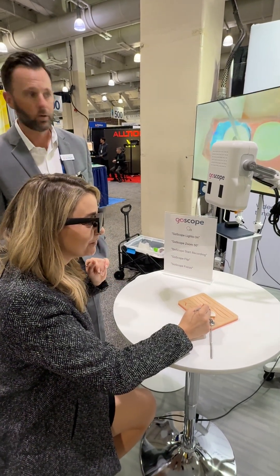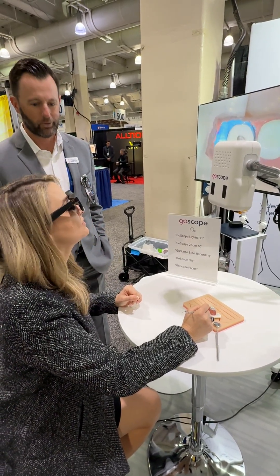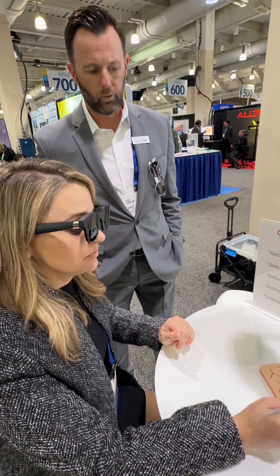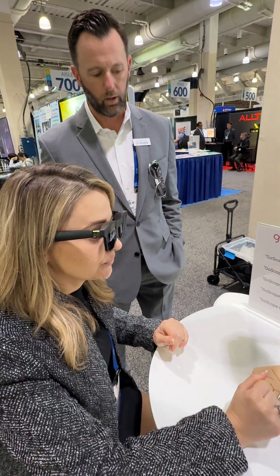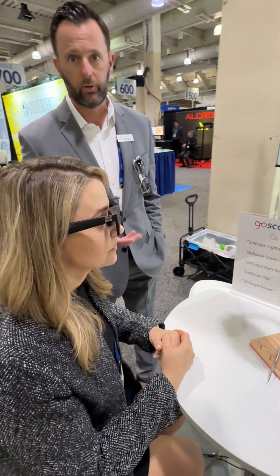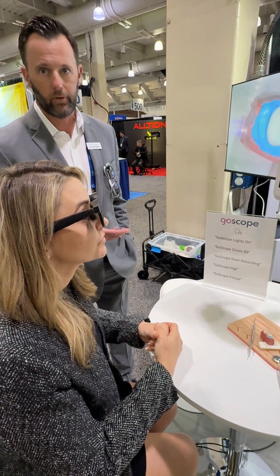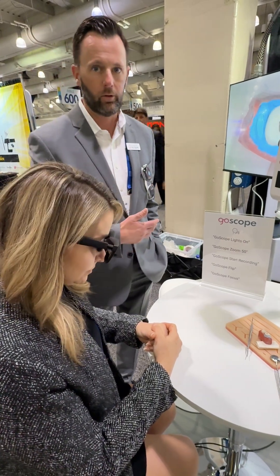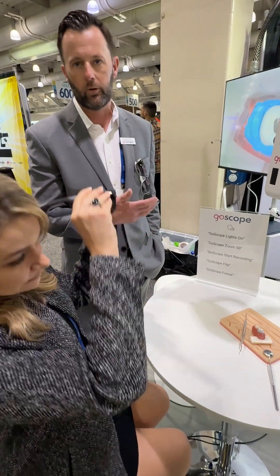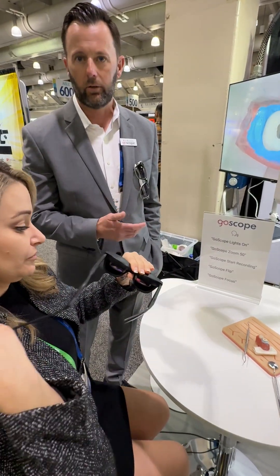Could she be on a beach staring at the ocean with those glasses and still see what's happening in her office? For university and teaching purposes, we actually have a software application called Telestration. That allows faculty members to view what the resident is doing in real time, and then draw on a tablet while the resident sees that drawing in their glasses. So you can show them to take a wall a little bit more mesial or distal, or in surgeries show where to create a window or where you need to resect a tooth from.